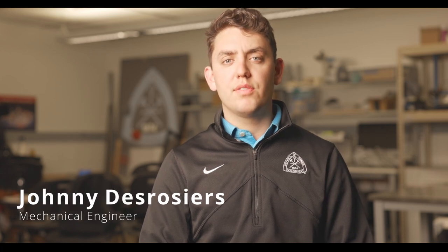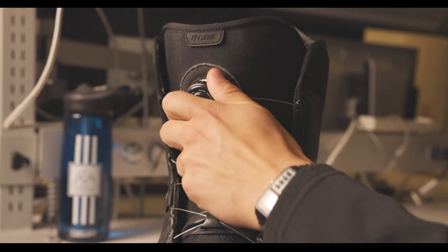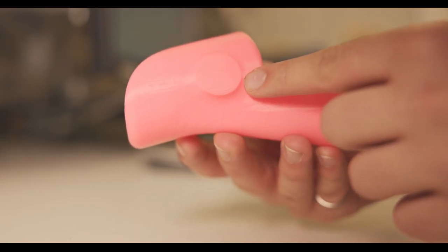TRS's original design for the Helix was more focused on other sports such as lacrosse or hockey, but it fell short in its design application for the game of golf. When we were first designing the Helix, it was difficult to recreate the complex geometries of Bob's original Helix. Originally, we wanted to incorporate a boa so that I can cinch onto the golf club and have a more secure grip on the club. Unfortunately, the boa requires a closed-loop system for it to properly function, and the complex geometry of the Helix only allows for an open-loop system, therefore compromising the design of the boa.